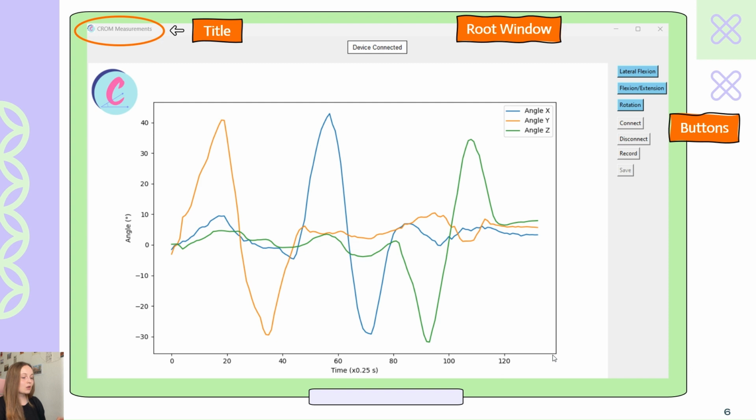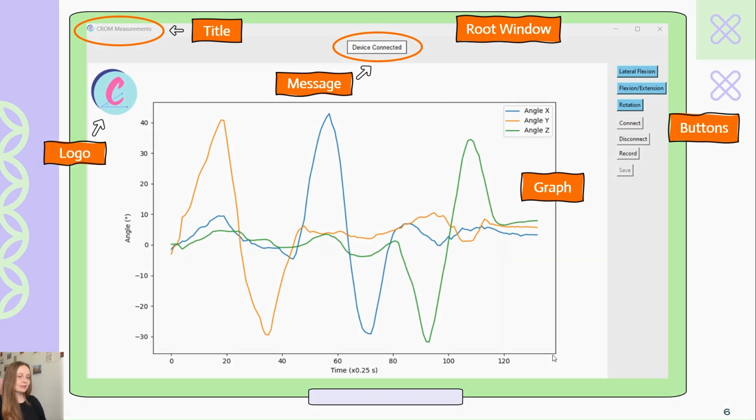When the record button is clicked, all the data that is being acquired by the sensor will be recorded. And when the save button is clicked, all the data recorded can be saved in a CSV or an Excel file. The user can choose a directory where he wants to store that file. We also created a graph where the depicted variables are represented. The first time the interface is initiated, all three plots will be depicted at the same time. Should our analysis focus only on a specific movement, we can deselect the other two buttons and leave selected only the button we're interested in. We also added a message appearing every time the device is connected or disconnected. And lastly, a logo for the interface.